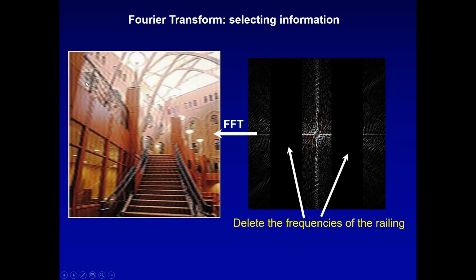And you can barely see them. Now that we wipe that out, we do a Fourier transform, you can barely see them. The stairs, those are mostly unaffected because for the most part, the stairs appear horizontal, and we wiped out vertical k-space components. So the stairs, they're a little bit affected because they're not quite horizontal in the picture. There's a little bit of an angle.